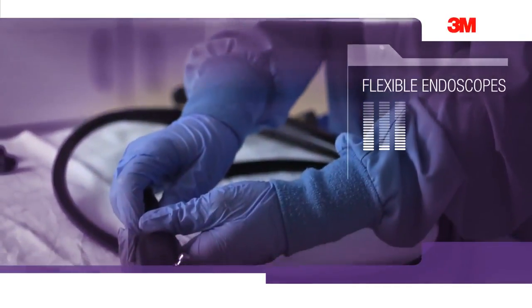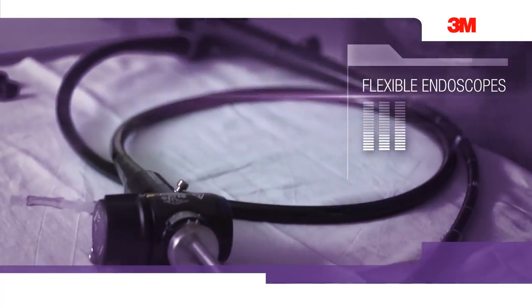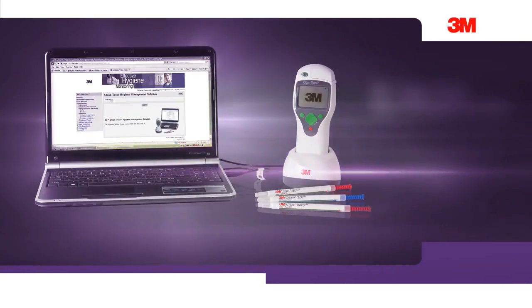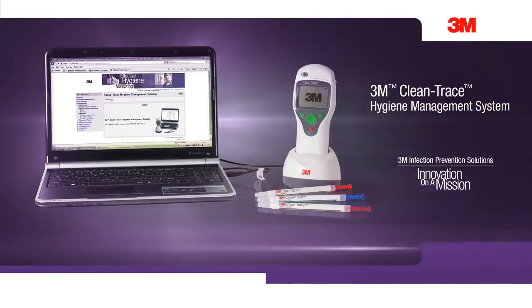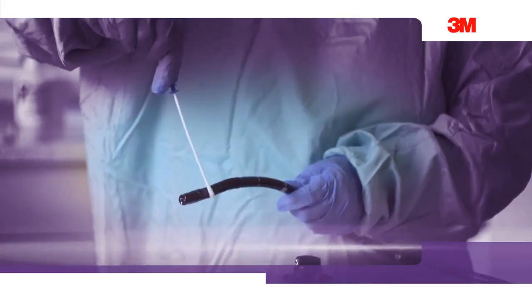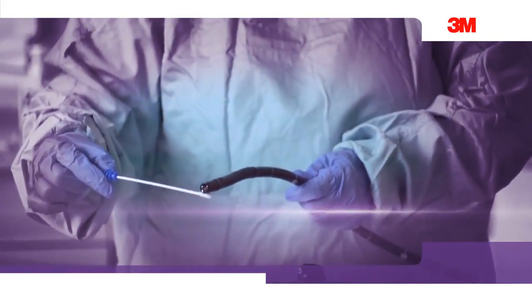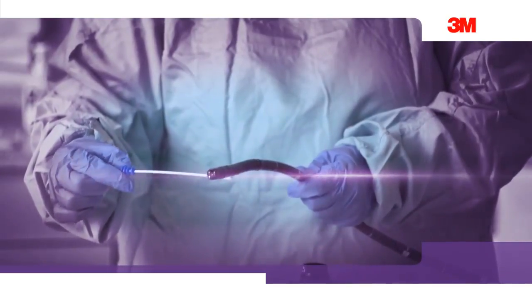Flexible endoscopes. In a healthcare facility, the flexible endoscope is possibly the most challenging instrument to verify cleanliness. The 3M Clean-Trace Hygiene Management System measures the levels of organic residue of both the external surface and internal channels. Sampling the outer surface of the endoscope's bending section follows similar principles as environmental surfaces and surgical instruments.